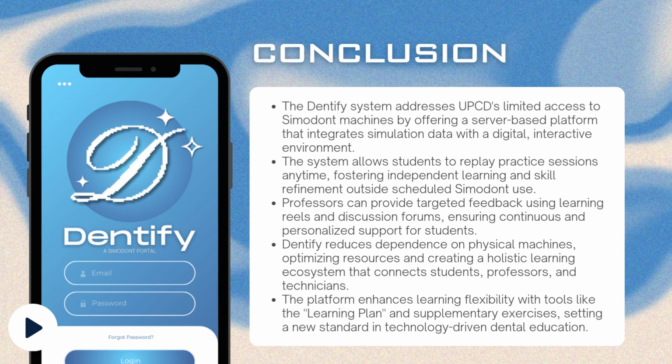By reducing reliance on physical machines, Dentify optimizes existing resources and creates a connected learning ecosystem that includes students, professors, technicians, and Simodont software. With tools like the learning plan and supplementary exercises, the platform enhances learning flexibility and sets a new standard for technology-driven dental education.